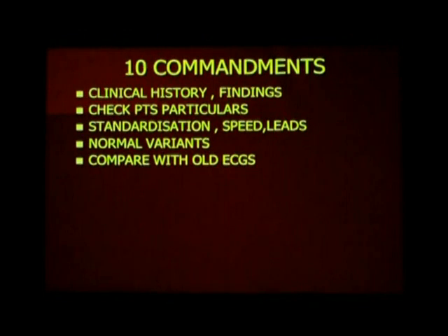new change you are dealing with. For example, you are so enthusiastic in your ECG reading, looking at the ST elevation, you would have thrombolysed the patient. And the patient brings a 7-year-old ECG. For 7 years he's been having a persistent ST elevation. You would think it is new, but the fellow would be having a persistent ST elevation due to ventricular aneurysm for the last 7 years. So you are dismayed, you find the ECG from 7 years back looks the same as the ECG taken today. So you wrongly thrombolysed a patient who does not require anything. That's why you always compare with the old ECG to decide whether the changes are new.